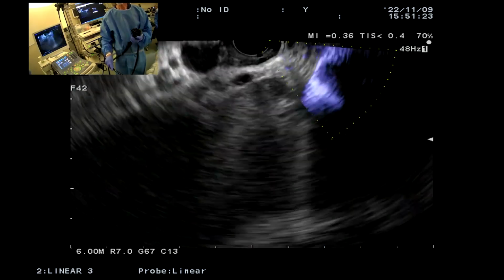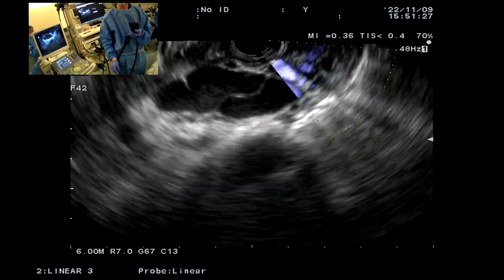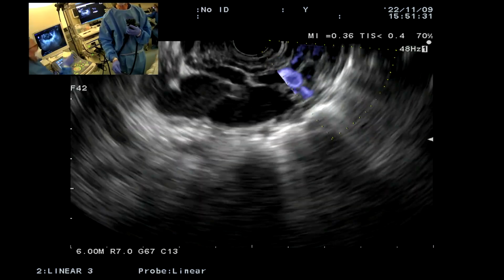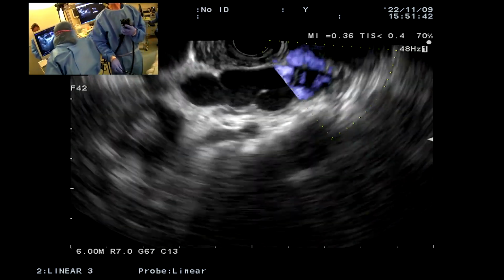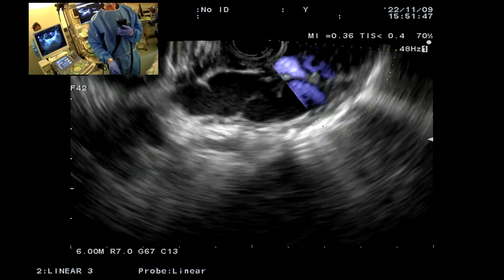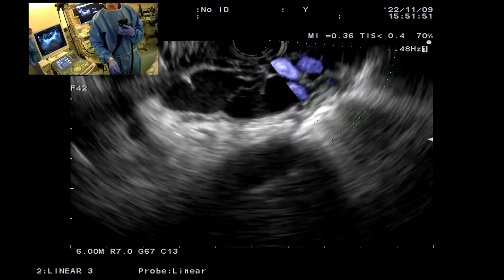So we're going to just band a few of the varices in the esophagus. I'm coming back. And here along the esophagus, I'm in the esophagus at 30 centimeters. Look at these huge collaterals. This patient had a second bleed after banding was done, I guess about a year ago or so, and now had another bleed.